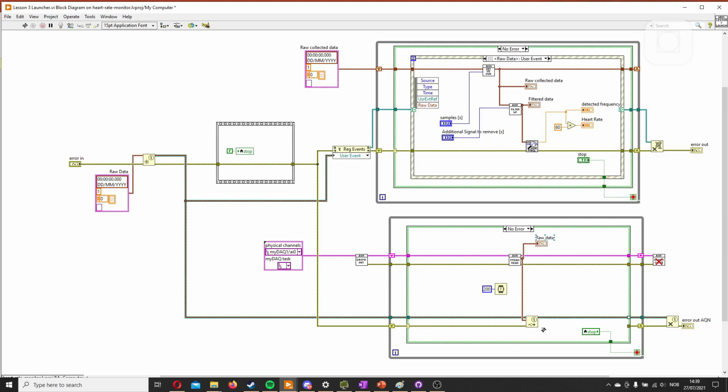So now we have a way that this data is being sent here, from here to here, while both of them are running. The other advantage with this, when no user event is being sent, it's on standby, which means it doesn't overload the CPU or use too much RAM. It just waits, doing nothing.